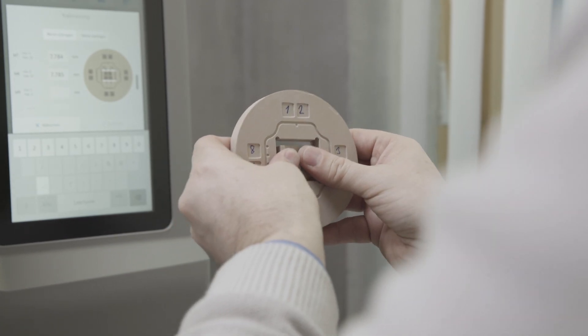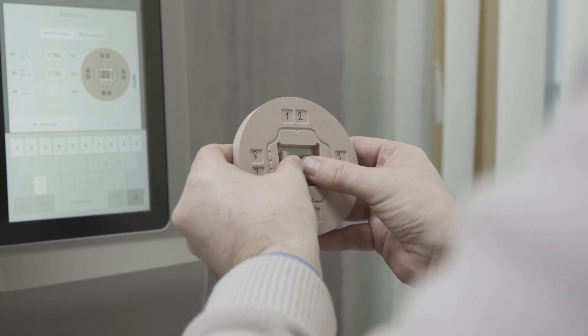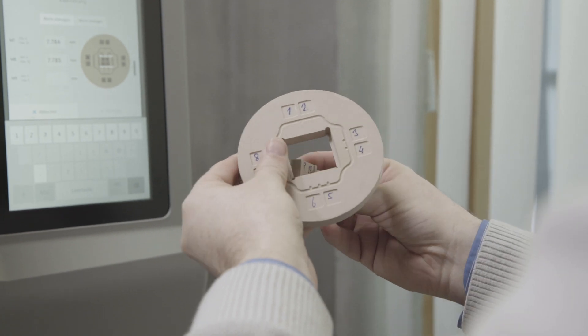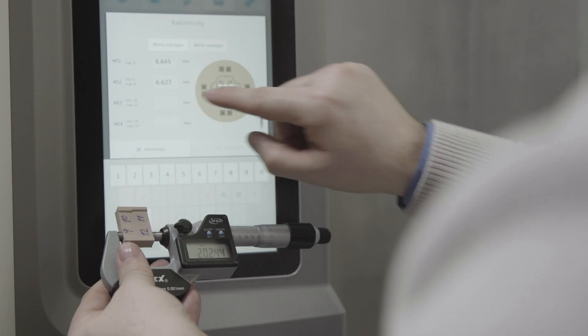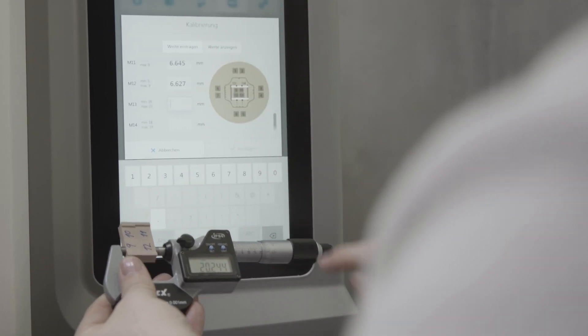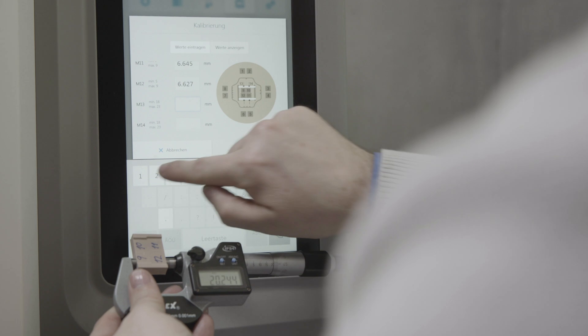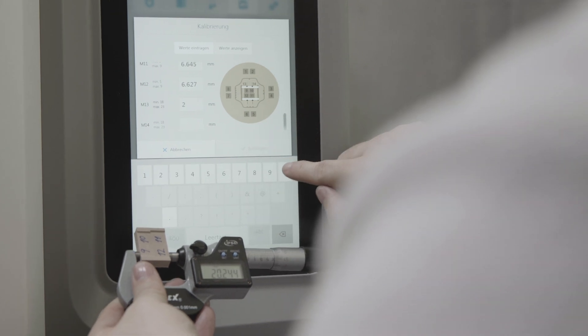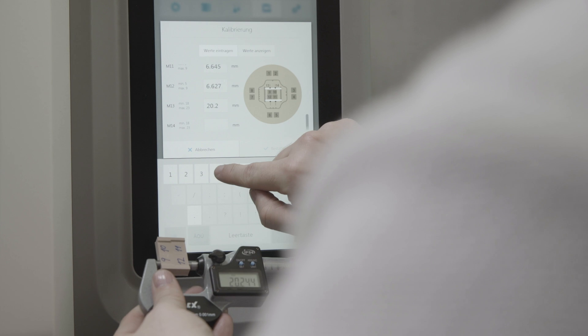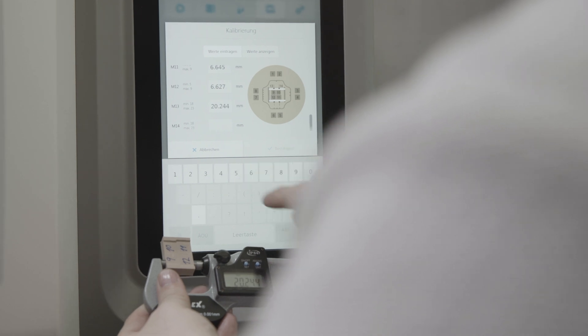Break off the middle part of the test specimen blank. Carry out the measurements at the measuring points shown on the diagram using an outside micrometer and enter the values in the respective fields.